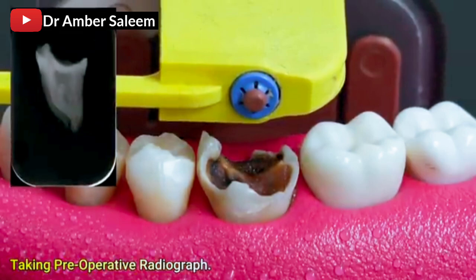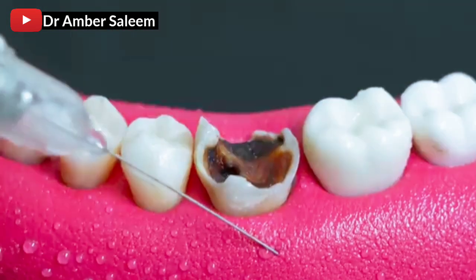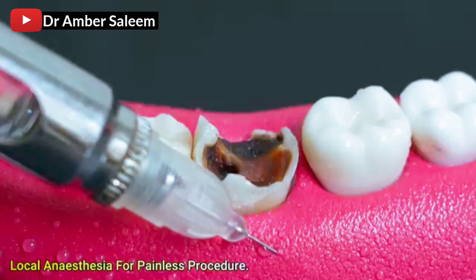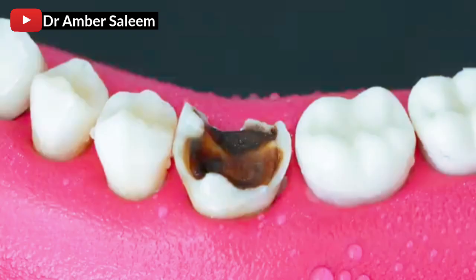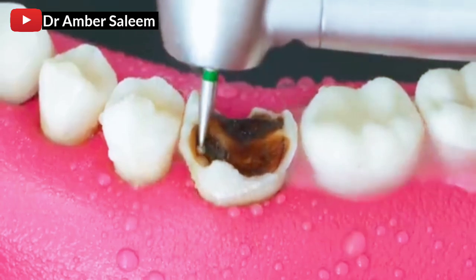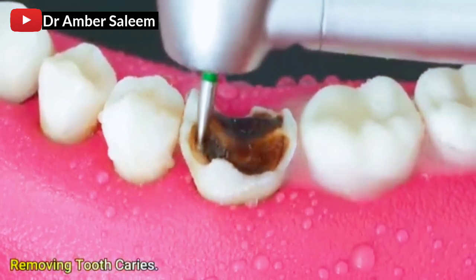Taking preoperative radiograph. Local anesthesia for painless procedure. Removing tooth caries.